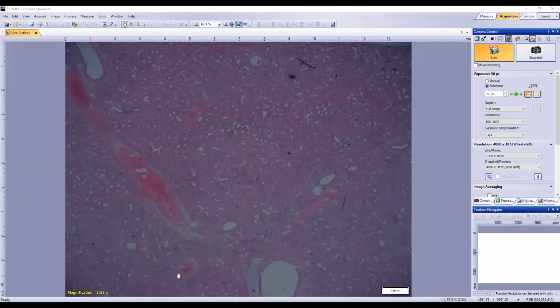Yeah, hyaline. Everyone else, chuck some descriptors out at us. That's what we're aiming for. We're building up a mental picture with jargon and terminology. Fibrillar, yes. Sometimes it'll be amorphous, if it's a little bit indistinct. What else? Now we're veering well away from our current lung and getting into our abscess. What else is going to be mixed in with that central necrotic material? Good, yeah, amorphous, anuclear eosinophilic material. Yep, love that, Anna.